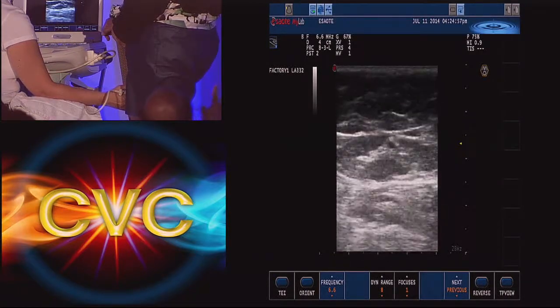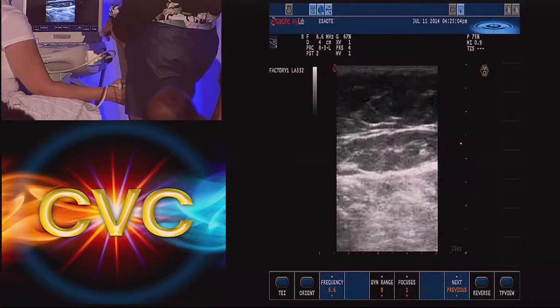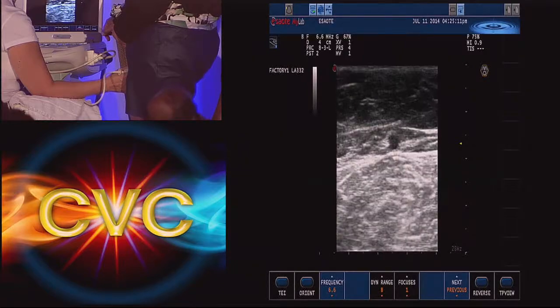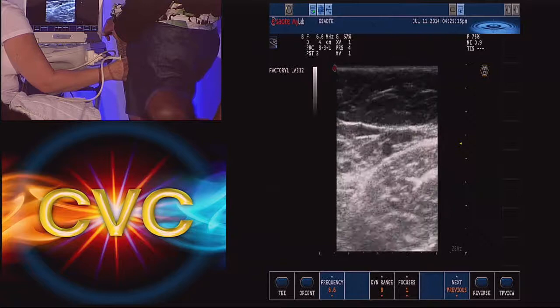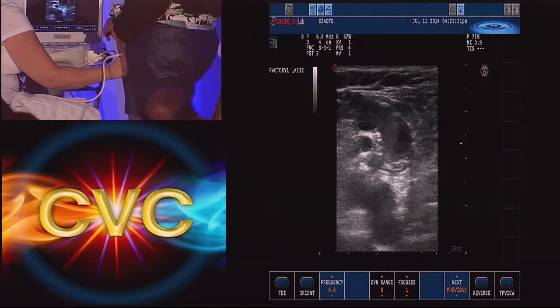Say it again, please. It depends. You can change it. What have you set it up for? It's a centimeter right now from here to here. Oh, the time. It depends. You can change the scale, so she'll show you in milliseconds. You just see it twirling around. So you can look at it longitudinally as well as transverse. They'll show you again.